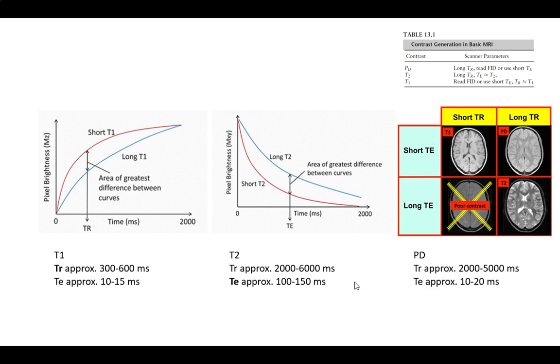Let's cover this one, and then the mid one I'll show you where it fits. It's again from those two. But you can again see right at T1, it makes total sense. Read out however you want to do it, either by FID or by an echo. If you're doing an echo, it's going to be short. But what you really care about is TR equals T1, setting that TR to be right about the spot where you're at the time constant for the system for T1. For T2, now the echo is what matters.